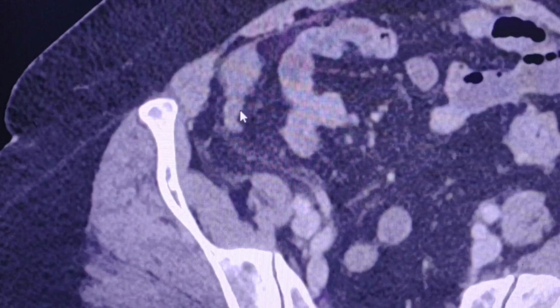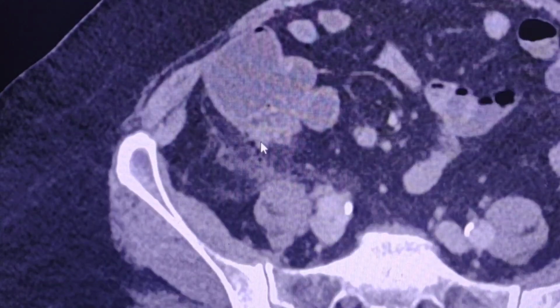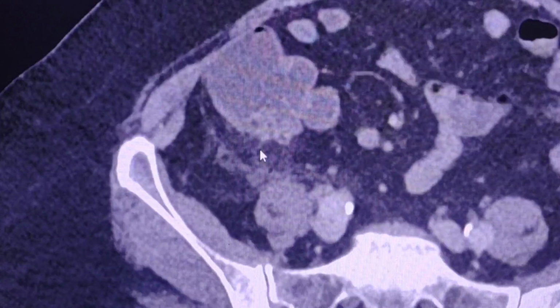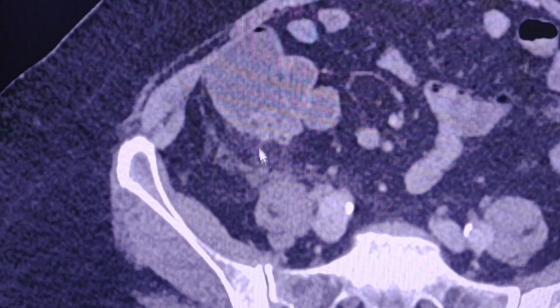and one there, and it goes on. And here at its base there are some other outpouchings, and there are significant inflammatory changes around its base.